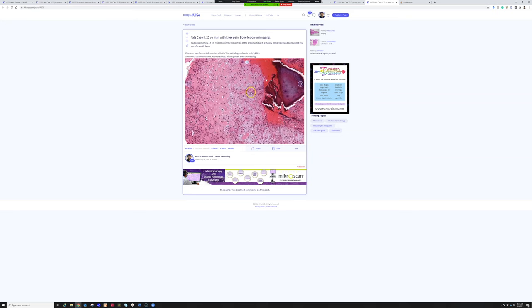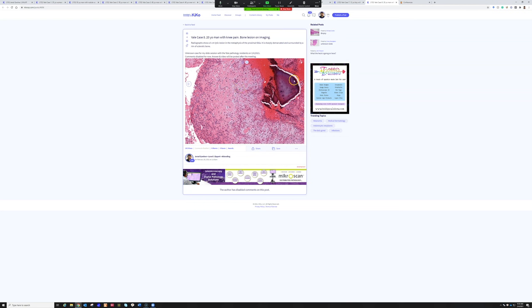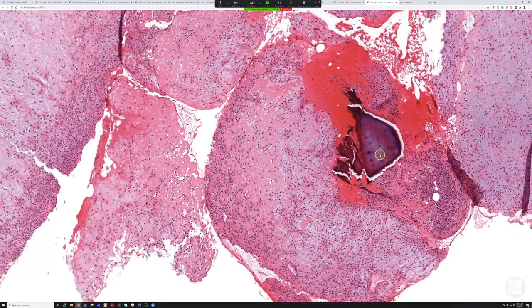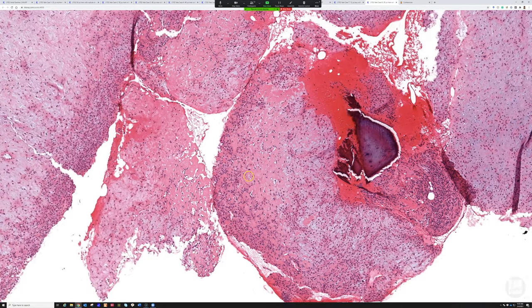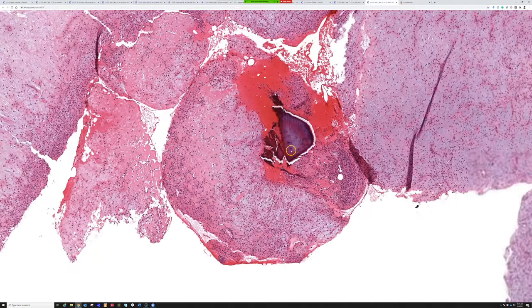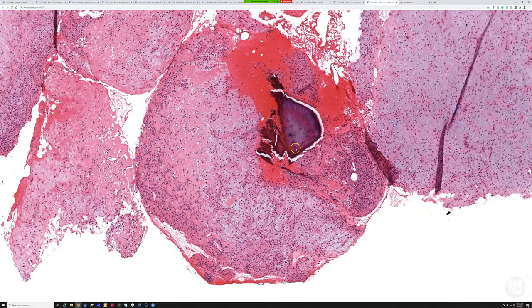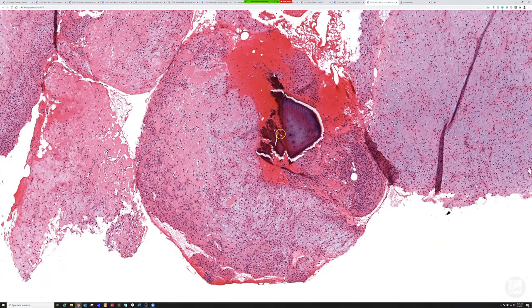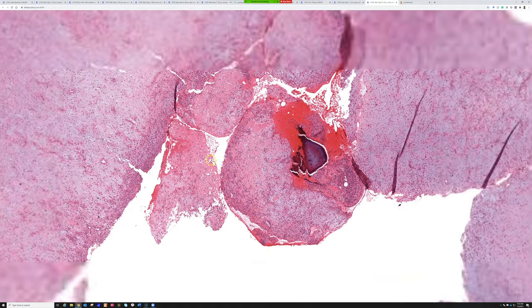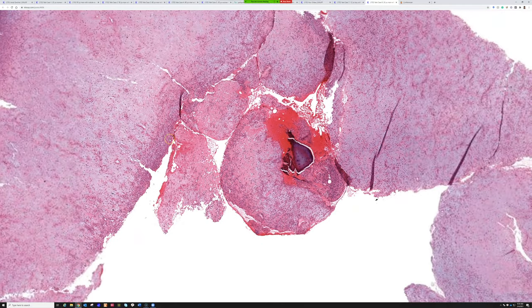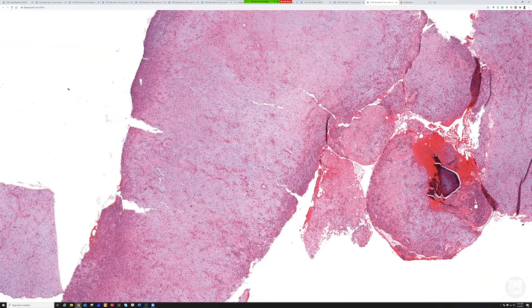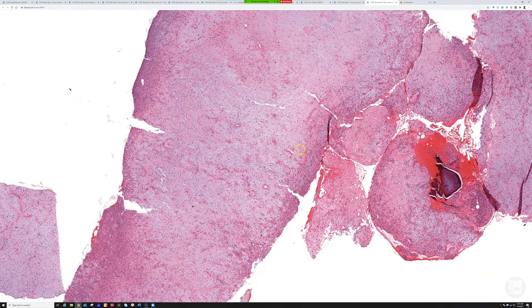Wait, here let me expand. Yeah, it's a bone fragment. It can be really hard to tell, especially when it's not decalcified—hard to see the features sometimes. Good pickup. Along with the radiology, I was thinking of chondromyxoid fibroma.